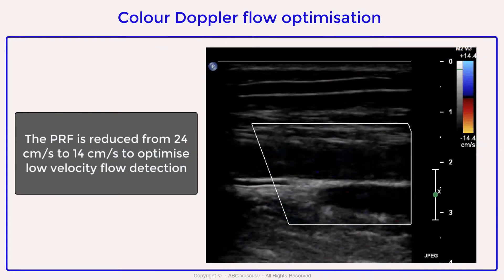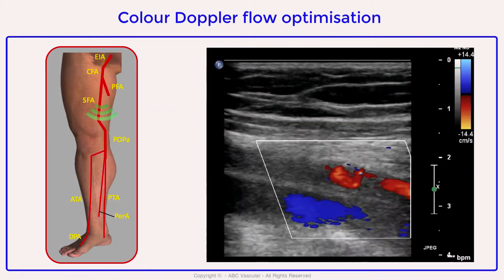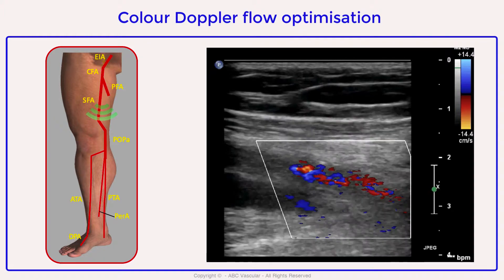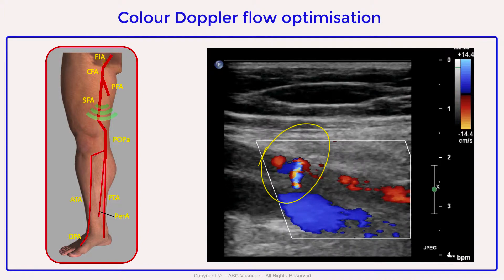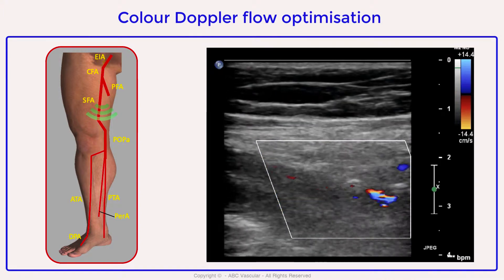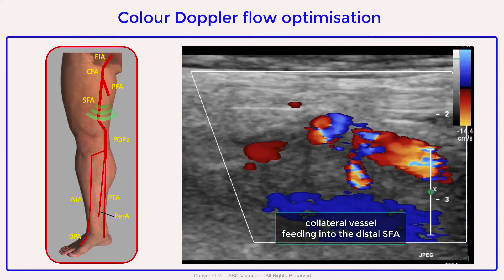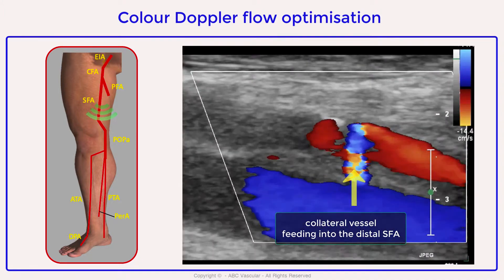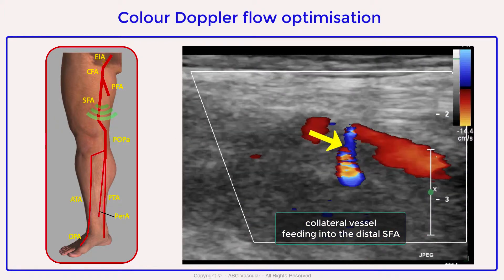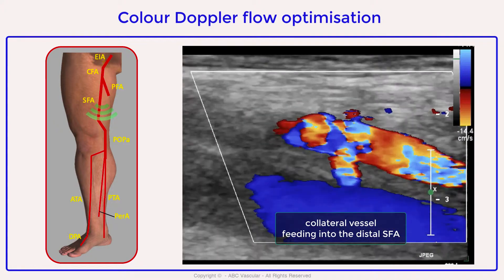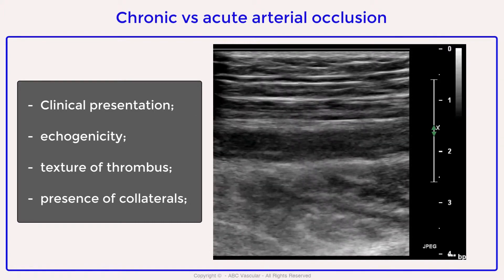We can see a segmental occlusion of the superficial femoral artery. As we move the transducer further down, we approach the distal part of the occlusion and can see that flow reforms at this level where aliasing is noted. The aliasing region indicates the presence of a large collateral vessel which reforms the flow at this level and feeds the distal region of the superficial femoral artery with arterial flow.